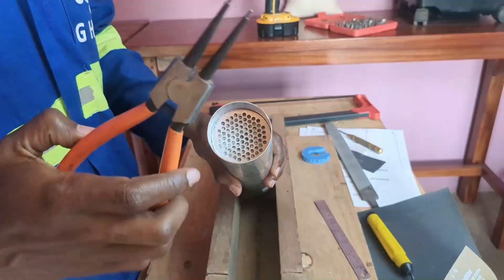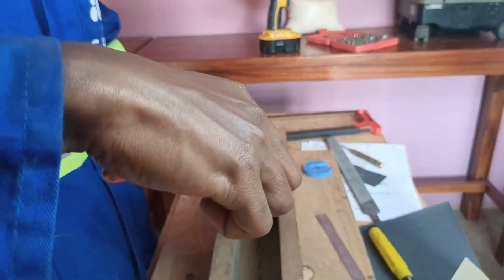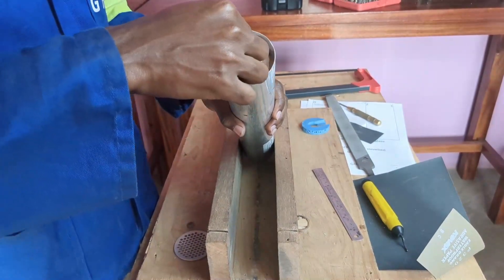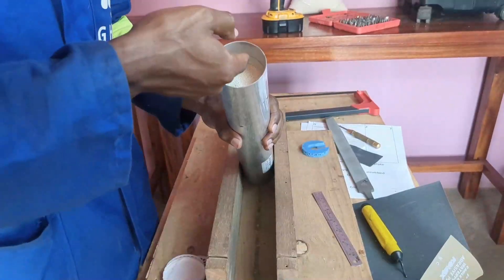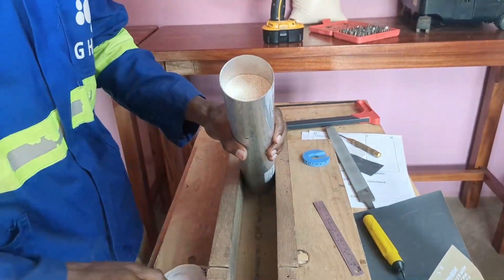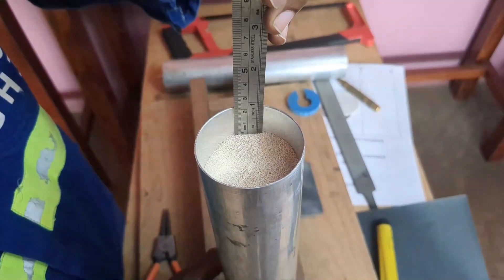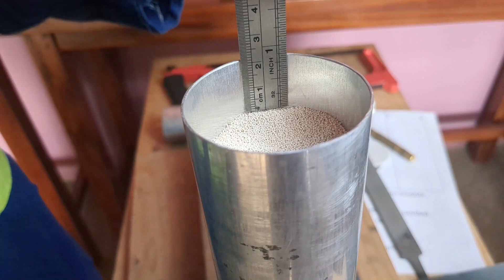Using the file, deburring tool, and sandpaper, smoothen the brim of the sieve bed until it is no longer sharp and is even, before removing the filter and the metal mesh. Using the needle nose plier, carefully remove the metal mesh and filter from the sieve bed. After that, using a ruler, take the level at which the zeolite sits from the rim of the sieve bed and note it down — it's usually in the range of 20 to 25 millimeters.